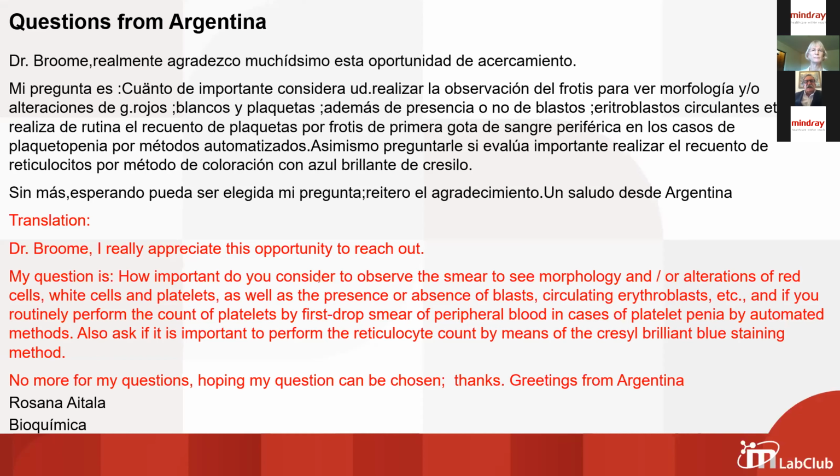Do you have a general cutoff percentage of spherocytes in neonates to say it is hemolysis? Oh, that's a good question. Babies' blood smears can have minimal central pallor, and it can be very challenging to say what is a spherocyte in a newborn's blood smear.